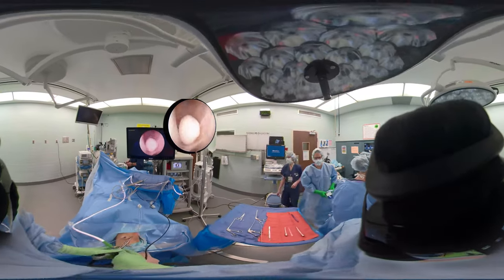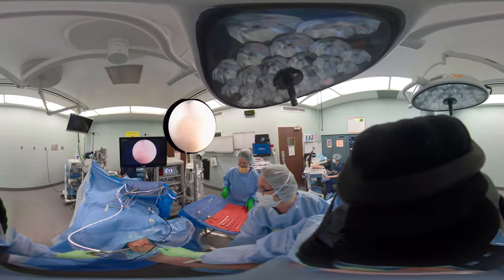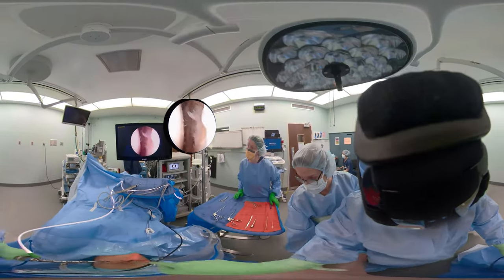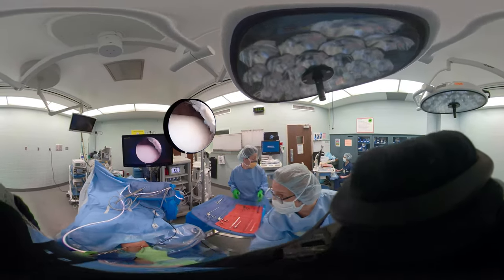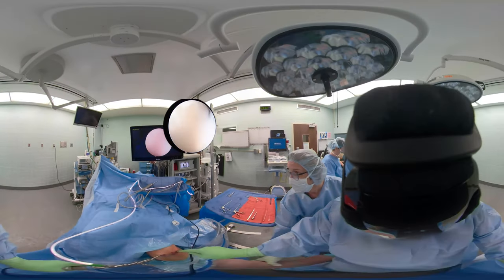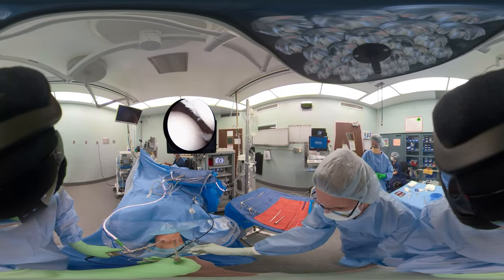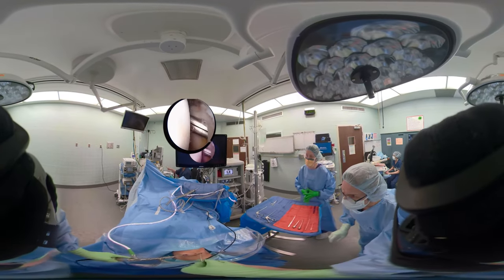So now we can see the loose body very well. We'll put the scope into the medial portal, and then we'll be able to put our grasper in laterally. You want to make a bigger incision so that it'll be easy to remove the loose body. The rookie mistake is losing the loose body in the soft tissue because you don't have a big enough mini arthrotomy. Keep your eye on the loose body. That little V is where the scope is looking. Now we have the instrument — a grasper called a Schlesinger Grasper — and looking into the lateral gutter, you can see where the loose body is.